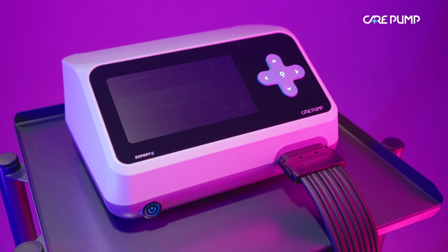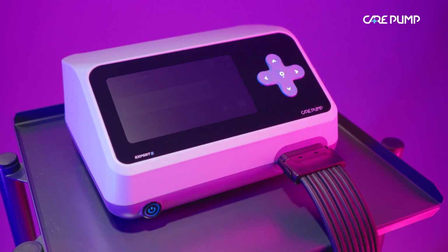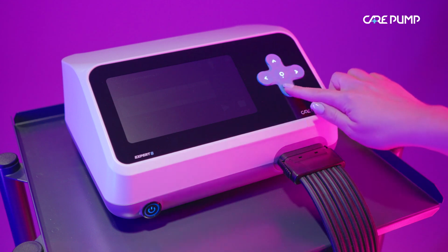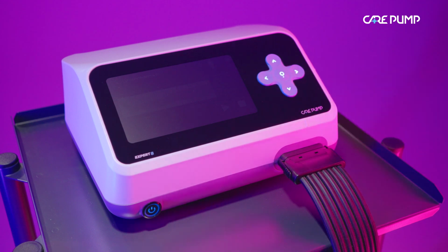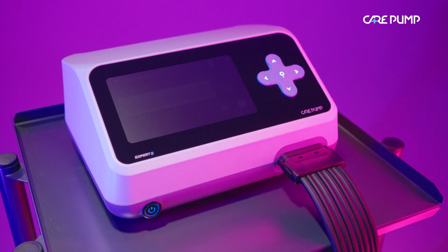Time 50 minutes, 45 minutes. Speed 5, 4. Chamber 1. Pressure 215 millimeters of mercury. 210 millimeters of mercury.